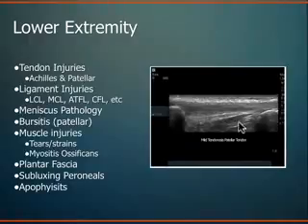This is that retropatellar area where you have the fat pad and a bursa, and you can see the anatomy quite well. You can see LCL quite well. You can see MCL quite well. You can't see ACL, PCL. Again, limitations of your modality and knowing what you can use it for. But you can see it for meniscus, and then around the ankle you can visualize those peroneal groups, ATFL, anterior talofibular ligament, all the common ligamentous structures that you see in your common ankle sprains. All these bursal sacs tend to be very superficial. You can image those quite well.